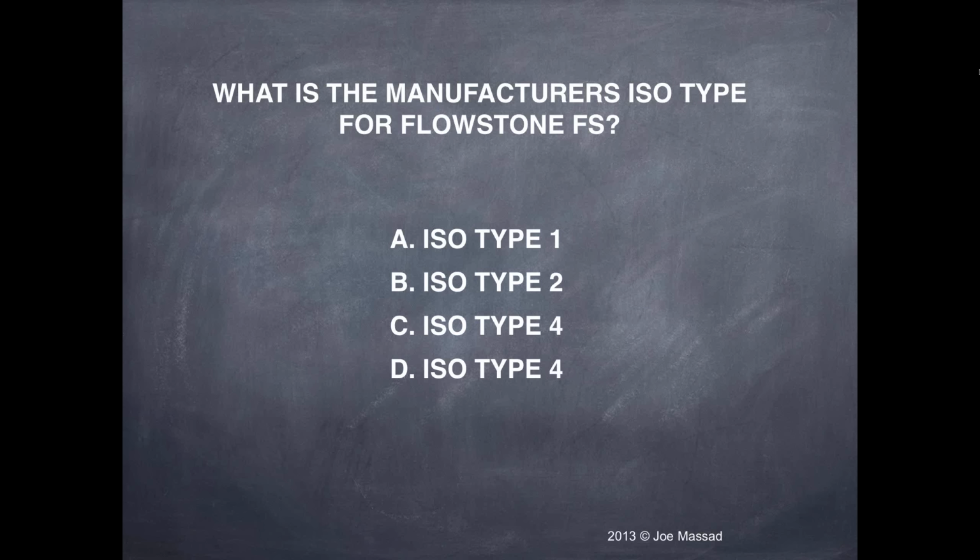I think a better answer would be, what type of soft tissue material are you using? Because there is a difference between those. And I think it should adhere very nicely without having to do a lot of extra work or put in any type of diatorics, because we don't even need diatorics for these. So you need to just look at the impression material, the soft tissue material you're using, or ask your technician which ones they've utilized, and that's the one that I would consider. But they're not all alike, so you need to understand what kind of soft tissue material you are utilizing.